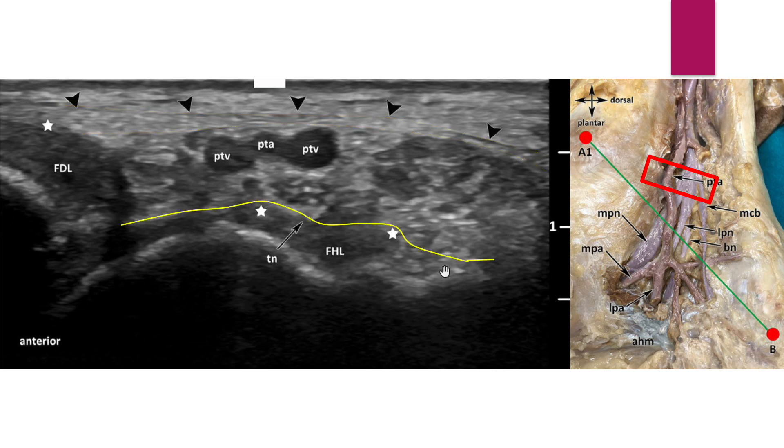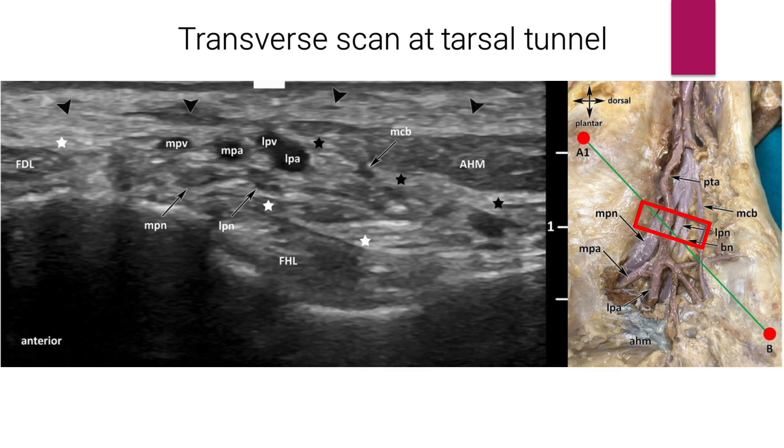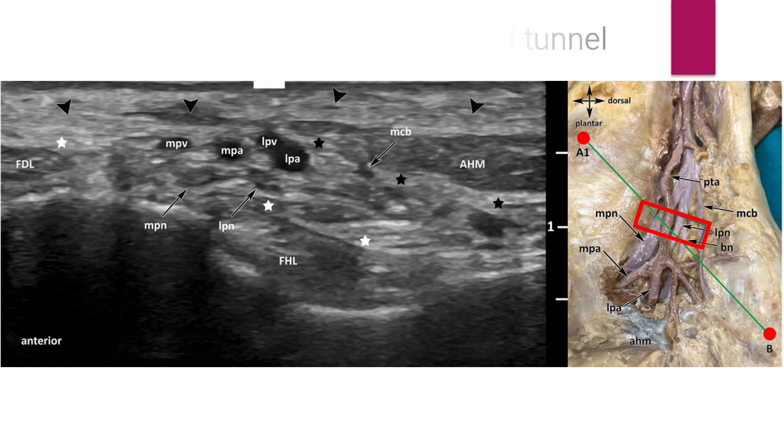The deep layer of the retinaculum is also indicated. The yellow circle indicates the artery and veins. Another yellow circle indicates the tibial nerve. The left image is the transverse scan at the medial malleolar calcaneal line.